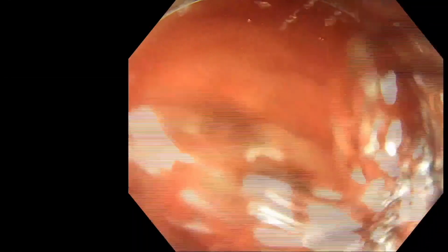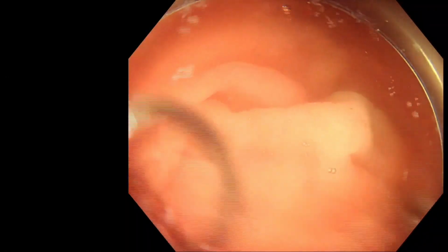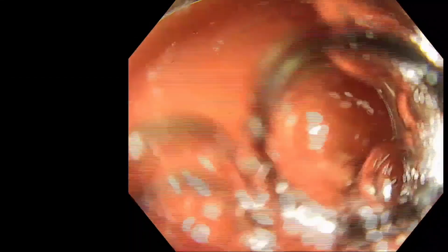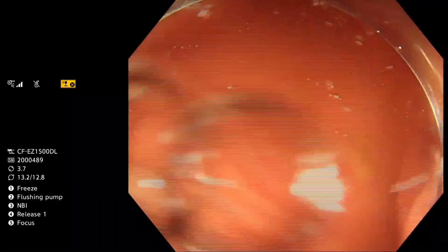Yeah, let's have an injector. You can stop that for me. I'll leave it, we may use it later. But we've stopped it. The 15 captivator. This is going to be difficult. Yeah. There's no doubt about it.